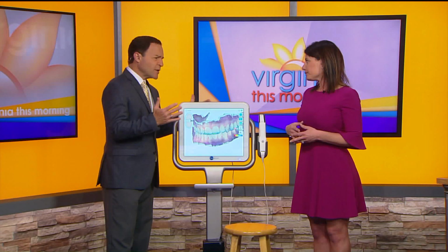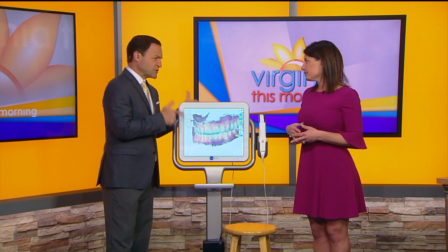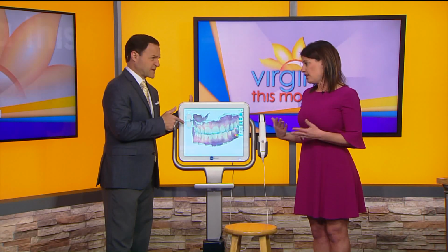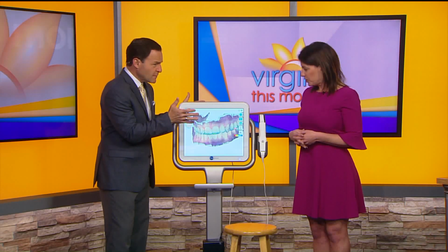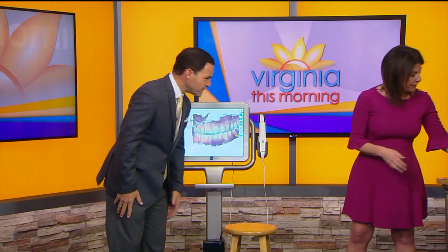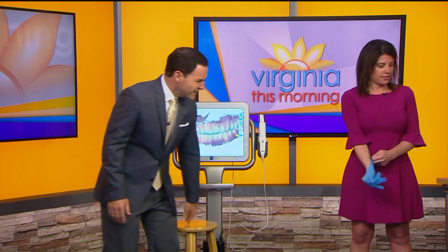Dr. Guthrie, how long is a person in the chair? For the scan? For the scan. Not more than 10 minutes. 10 minutes? Yeah. Can you at least show us how it was done? Sure. All right. What do we need to do right here? Okay, I'm going to put on some gloves because Greg's a pro at this now. There we go. He's had it a few times for crowns and bridges and implants.